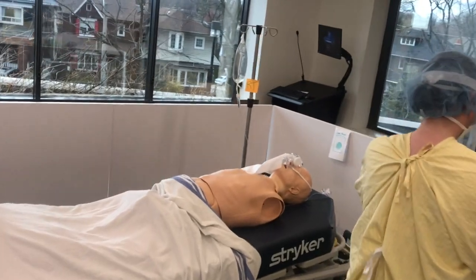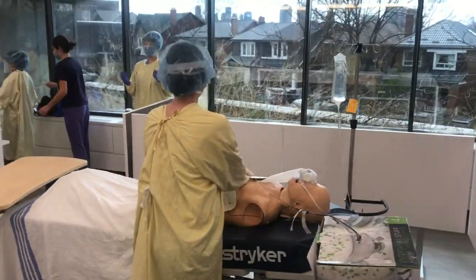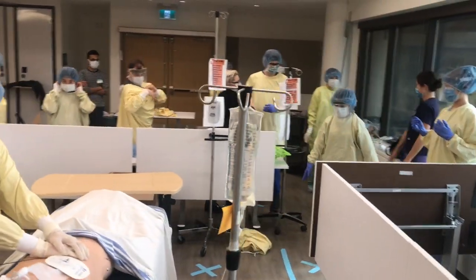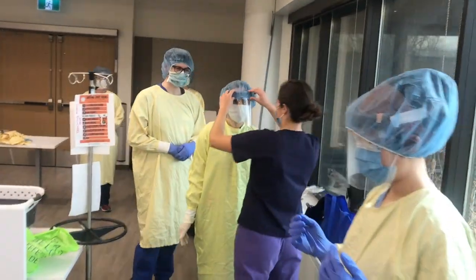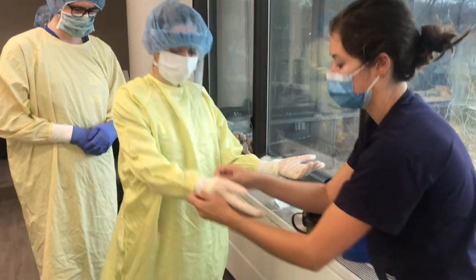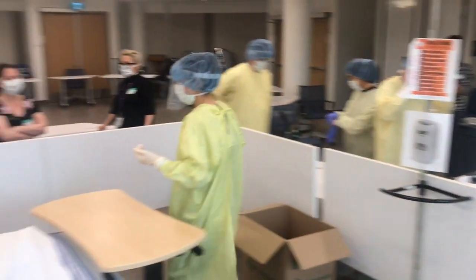So the first nurse has come in, she's brought the defibrillator and found this patient. She puts the pads on and immediately begins CPR. You can see here again the safety officer is checking each member before they enter the room in order to clear them. Very dangerous if someone enters the room and their N95 has not been seal tested, for instance. So she's starting top to bottom systematically every time, checking the bouffant, checking that the face shield is tipped down, that the N95 has been seal tested, that the gown is on appropriately tightly at the neck, and she's optimizing everybody's wrist coverage at the gloves.